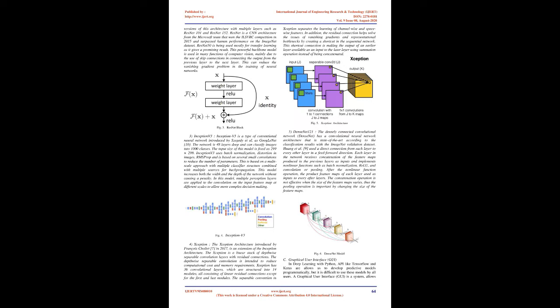The COVID chest X-ray dataset 1 on GitHub is the first public COVID-19 chest X-ray image data collection. The collection gathered 542 frontal chest X-ray images from 262 people from 26 countries, including 434 images of COVID-19, SARS-CoV-2 patients. Currently, all images and data are released under the GitHub repository 2.